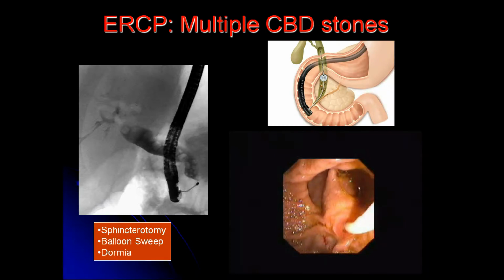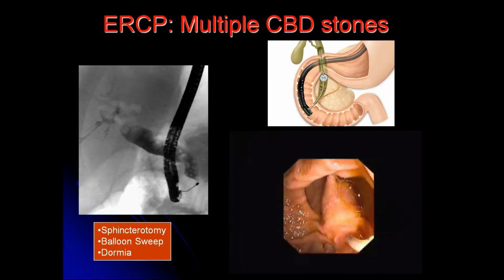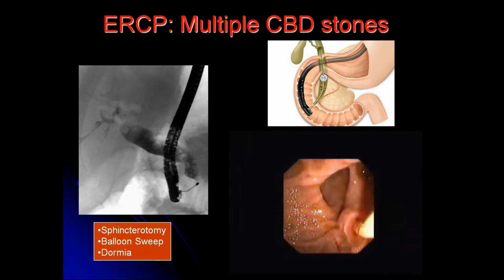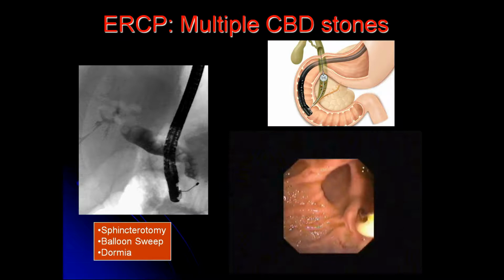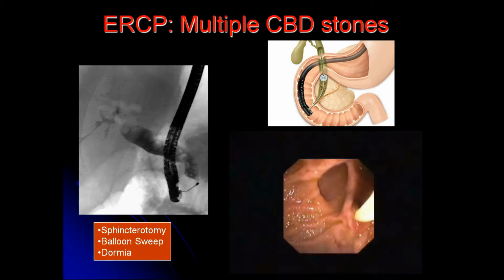This ERCP picture shows multiple stones in the bile duct, and as you can see in this video, the ampulla is entered by a bow-like wire. There is a sphincterotomy. The ampulla is surrounded by a periampullary diverticulum. The bow-like wire is stretched and monopolar diathermy energy is applied, and the ampulla is divided and enlarged to the size of a centimeter.